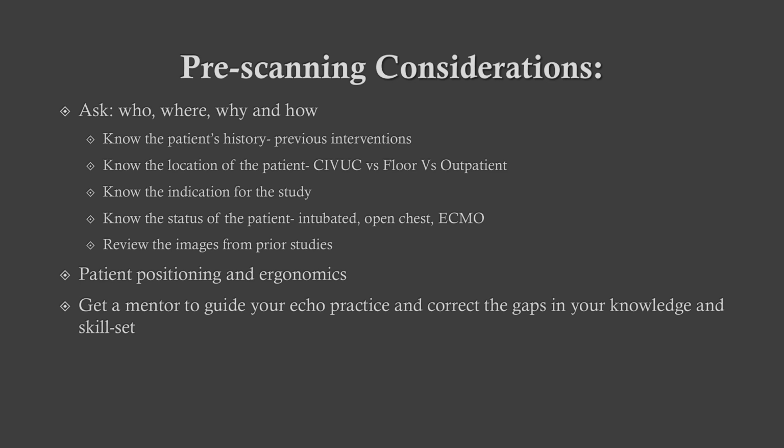Is the patient admitted in a CVACU area, on cardiac floor? Is the patient an outpatient? Very important to know the indication for the study. Also know the status of the patient. Is the patient intubated? Does the patient have a trach, an open chest? Is the patient on ECMO?